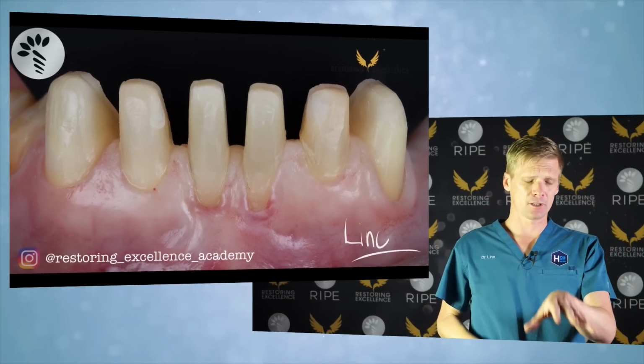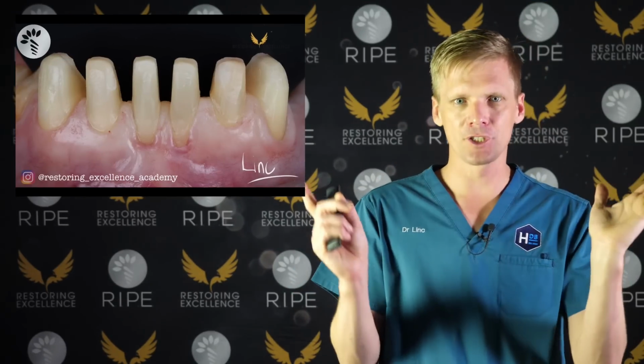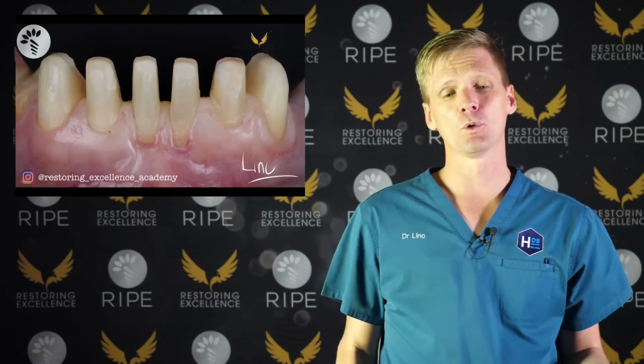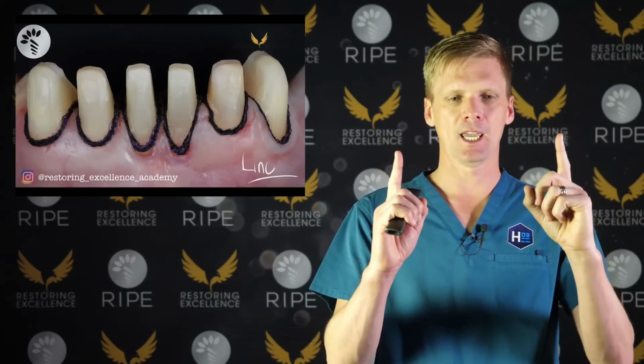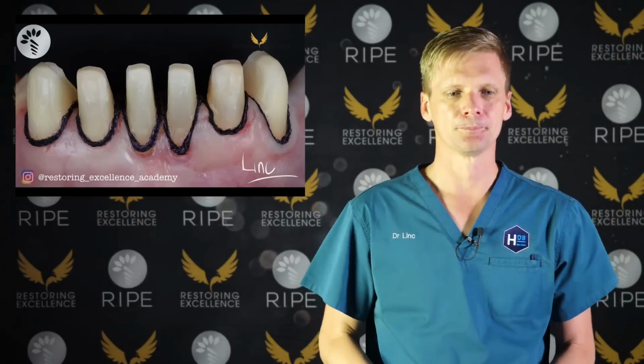So I took this photo. You see a lot of things in photos. I took the photo and then I noticed that there was this divergence and I was going to have trouble getting the impression, and also the impression would likely tear or pull when it came out. So I corrected it between the last photo and this photo. One of the things I did there was just correct divergence if you can. I took a little bit off the distal of that tooth so that they were all a little bit more parallel.